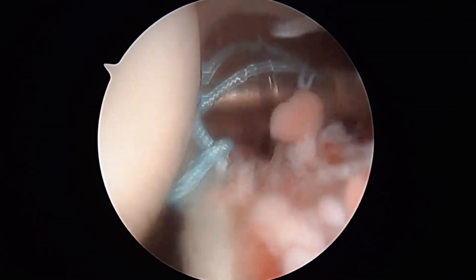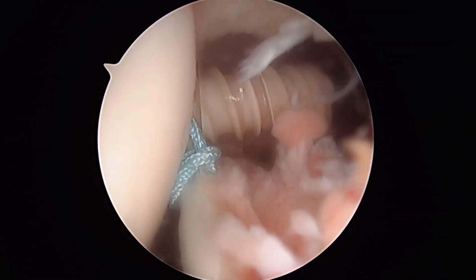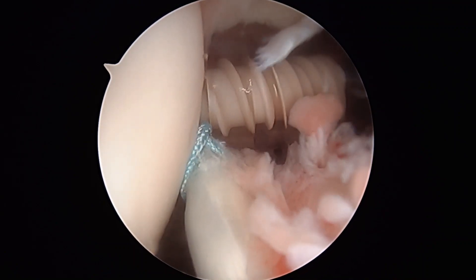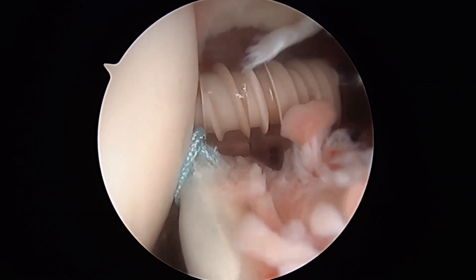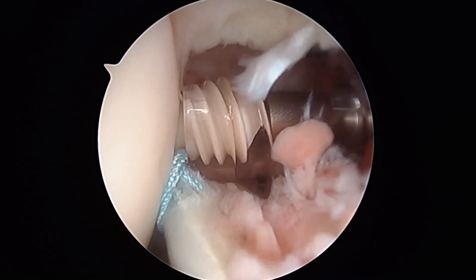It is then mounted to a depth of one screw thread into the humeral head. Tensioning on the biceps can be adjusted at this point by pulling on the sutures. Once the tension is appropriate, the paddle is held and the anchor wheel is deployed in a clockwise manner.